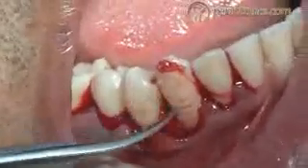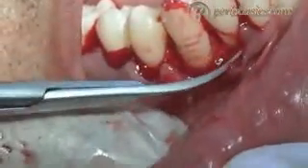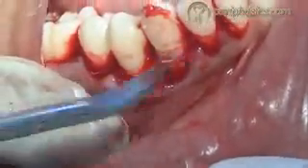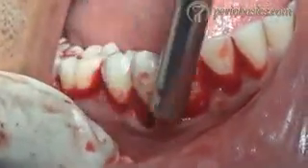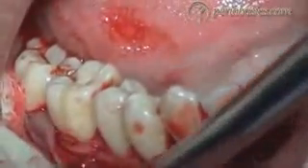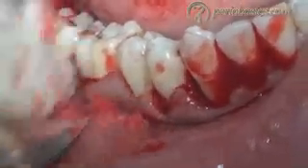With the help of curved scissors or Castroviejo scissors, you can remove the granulation tissue from the inner surface of the flap. The margins of the flap may also be trimmed so that they nicely adapt to the root surfaces. And we have to inspect the bony defect. If there are any bony irregularities or bony protuberances, then we have to do bone reshaping.